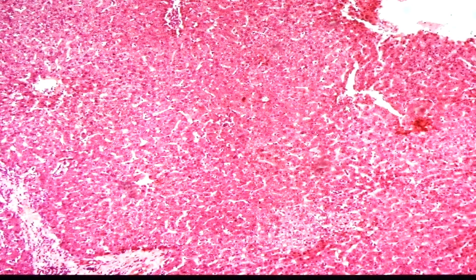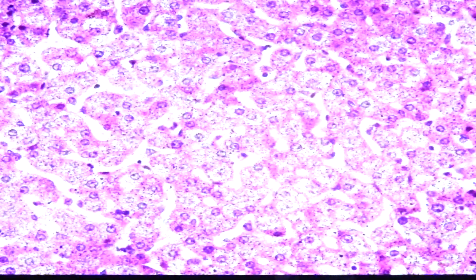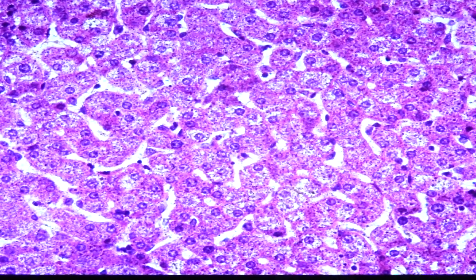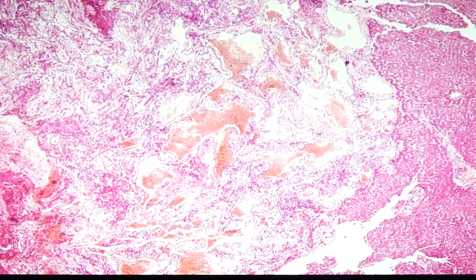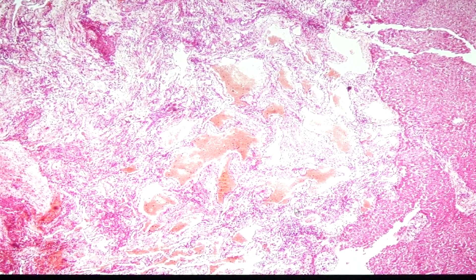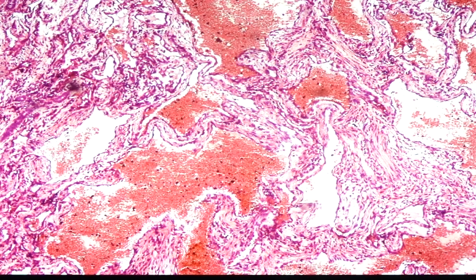Our last slide for today would be hemangioma, slide 144. For purposes of orientation, this tissue would be coming from the liver, which is composed of hepatocytes and the spaces here would be sinusoids. What would be notable here would be the adjacent structures to the liver tissue — spaces that are filled with red blood cells. This is part of hemangioma.